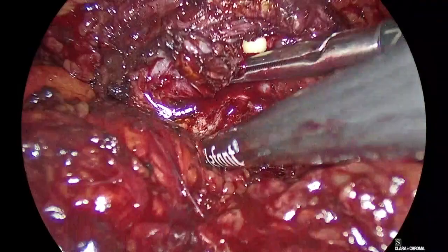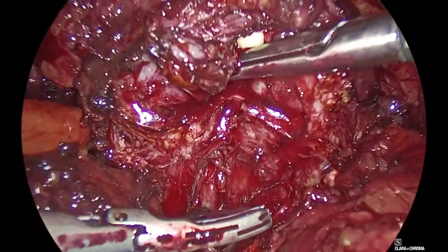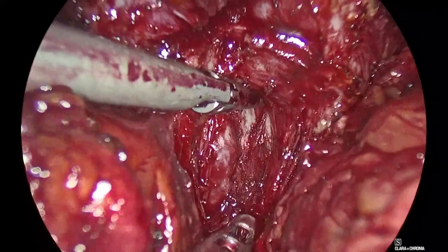Good. Okay, so we are here nicely in our field. You can already see the vas here, huh? This is the anterior denonvilliers fascia here. I would be happy if we would be drier. Panagiotis, do not aspirate all the time. We're losing gas.